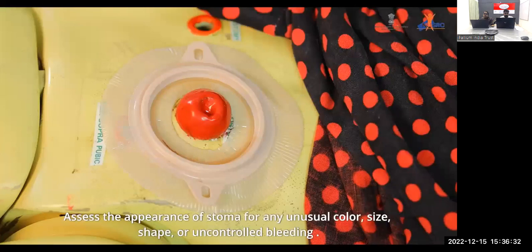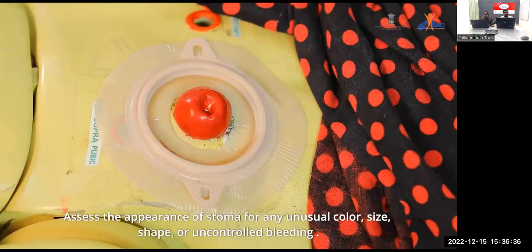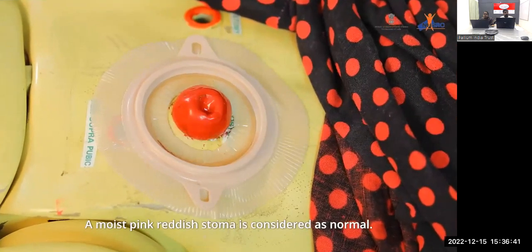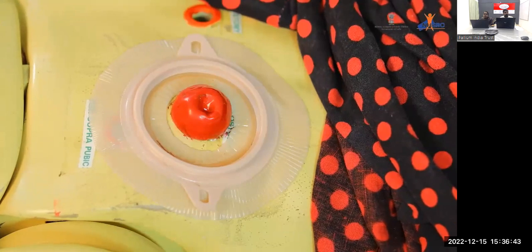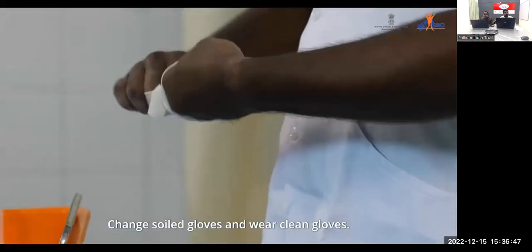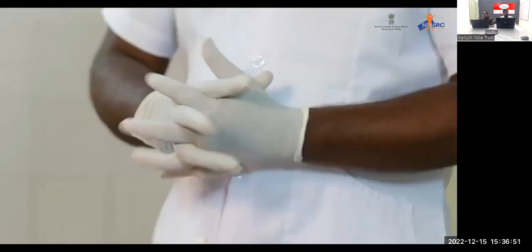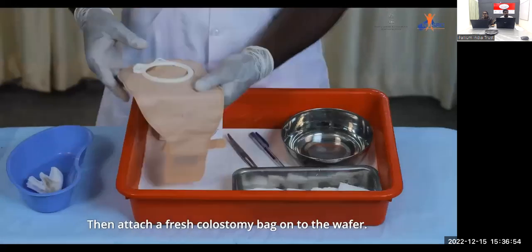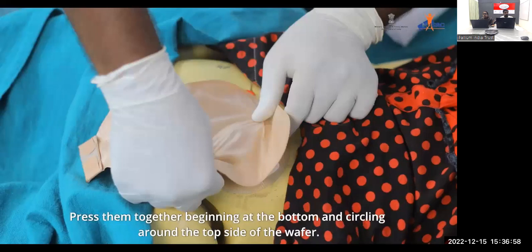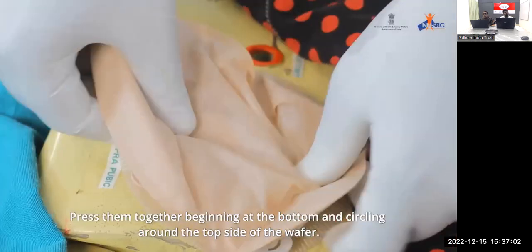Assess the appearance of the stoma for any unusual color, size, shape, or uncontrolled bleeding. A moist pink reddish stoma is considered normal. Change soiled gloves and wear clean gloves. Then attach a fresh colostomy bag onto the wafer. Press them together, beginning at the bottom and circling around the top side of the wafer.